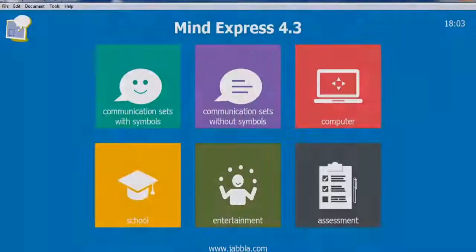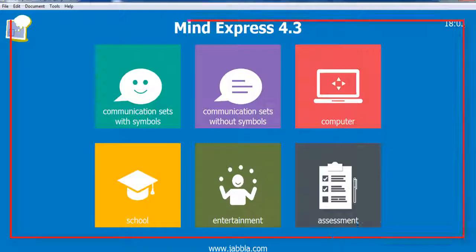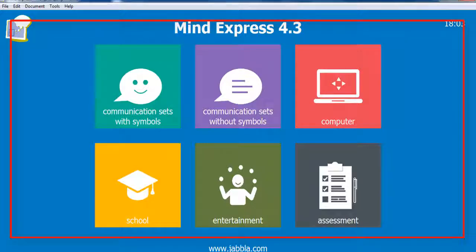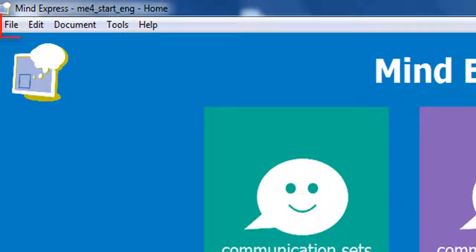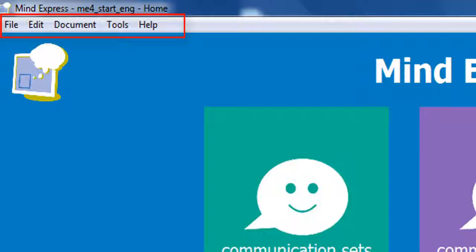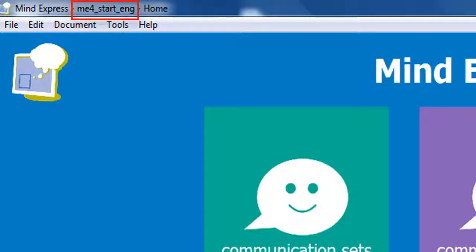This is the MindExpress window. It has different areas: a main working area where all cells and interactive elements are located, a menu bar that gives access to the file, edit, document, tools and help menus, and a title bar that shows the name of the program, MindExpress of course, the name of the file and the name of the page you are on.